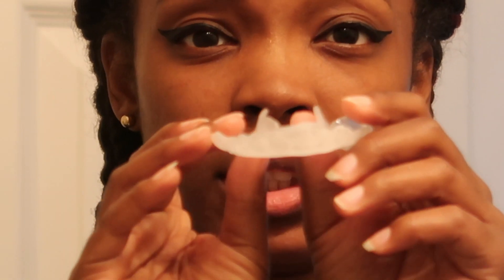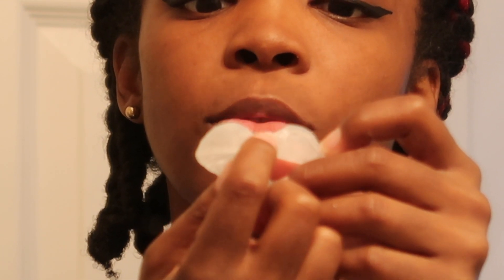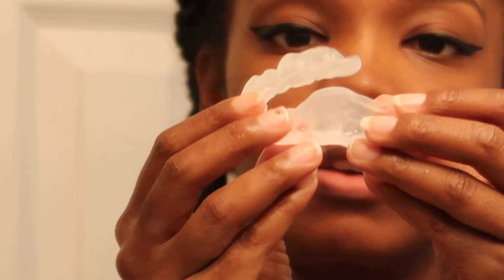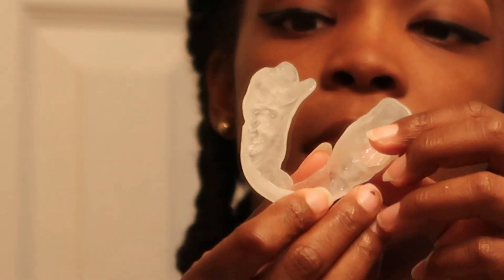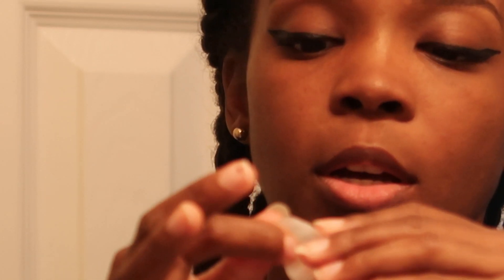Now once you take it out, you want to check to see if there are any see-through bits because that means it's too thin. There is a little piece right here on this tooth that's see-through, but it should be okay because it's in the middle of the tooth and not at the top. So I'm just going to rock with it. And then if you notice, there's this excess bit right here — I'm just going to cut that off. I also want you to notice that this goes up and around the tooth. I might shave this down some so it's not so thick, but you want it to go up and around the tooth so that your tooth does not move.